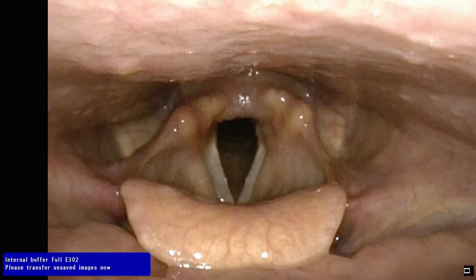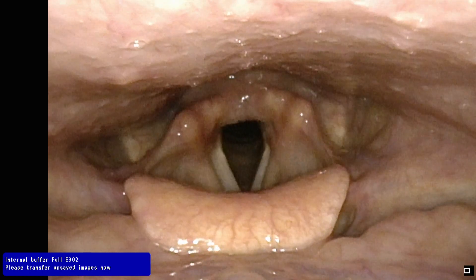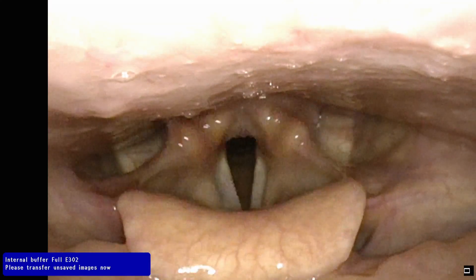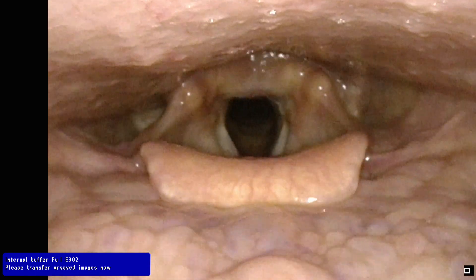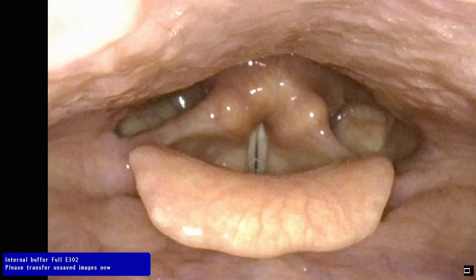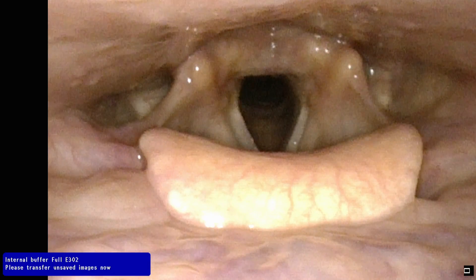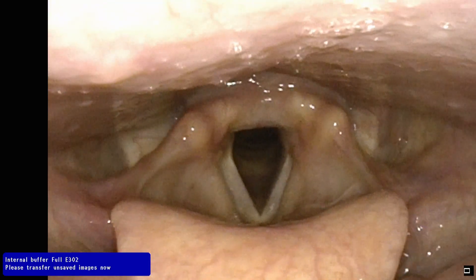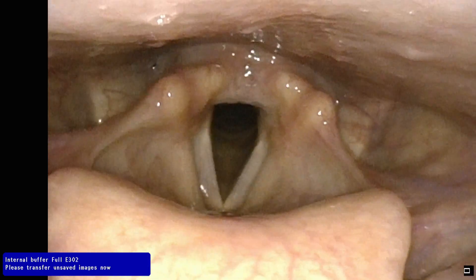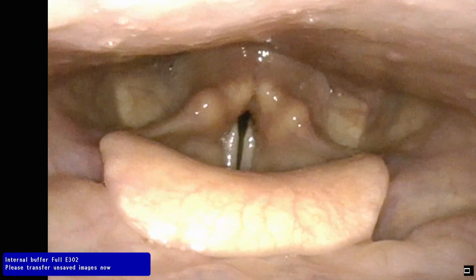Good. So what I noticed there — did you see how the pharynx kind of contracted in, like it almost looked like a taco shell, kind of folded a little bit? I would have to kind of be looking for it all the time, I think. Watch the back wall of your throat, that back wall, and then do that high-pitched E again. Yeah. And relax. So that's the pharyngeal — I was wondering if you were engaging those pharyngeal muscles. So you are a little bit. And then when you try to go really high, try to go really, really high — let's see how that's so compressed in there. So lots of compression, and did you see how your tongue kind of pulled back as well? So lots of tension with that, I would say.